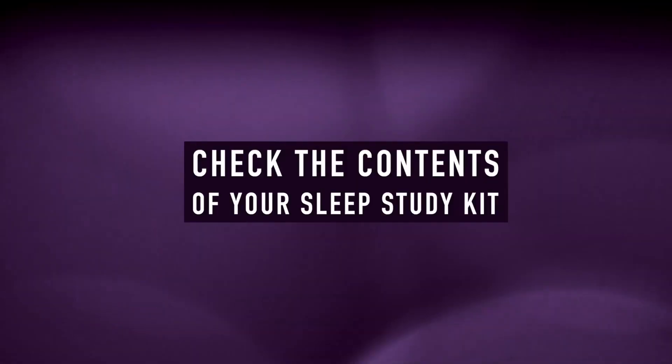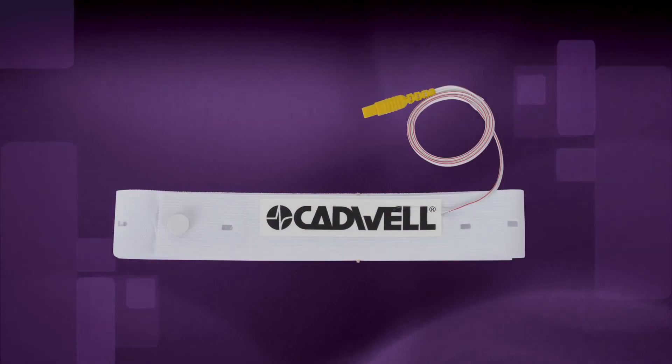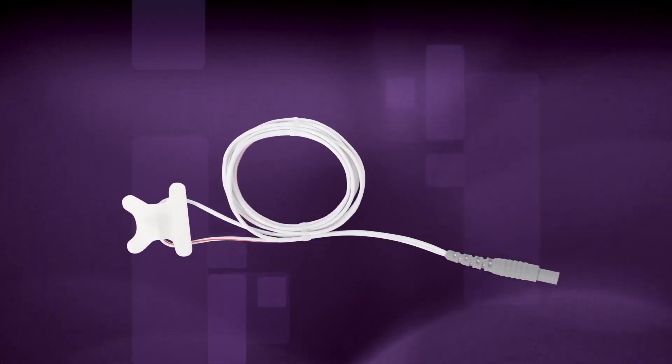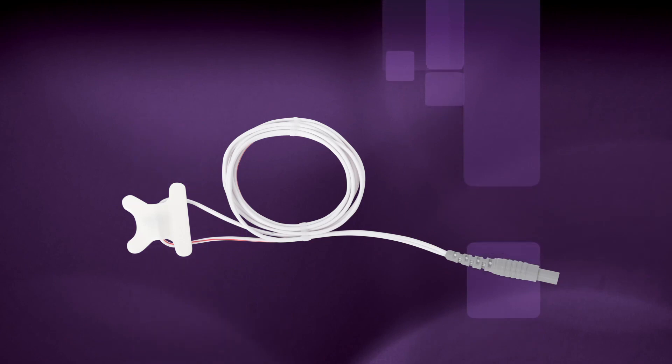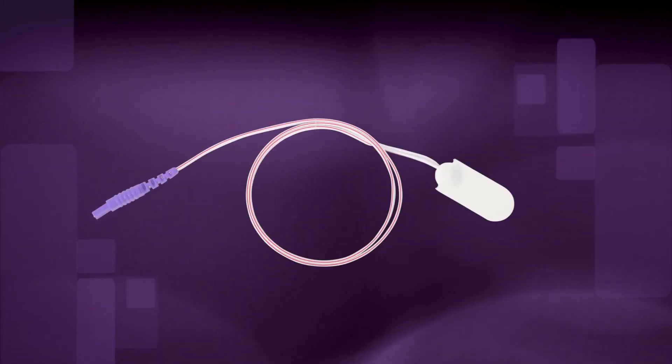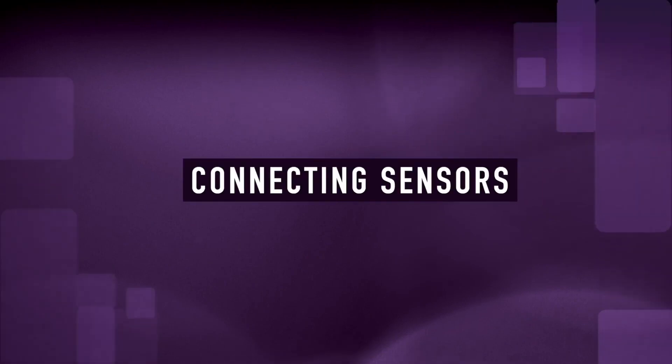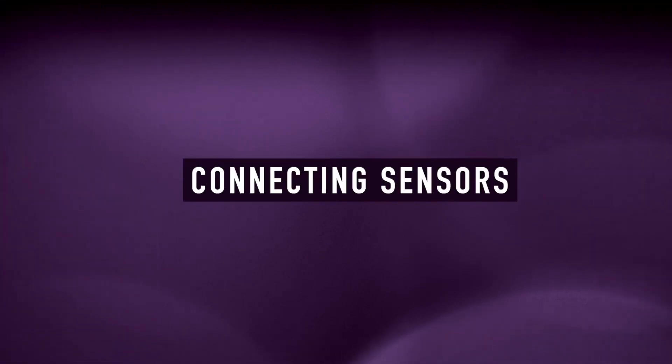As you prepare for your home sleep test, please check the contents of your kit. Verify you have the apnea track, a chest effort belt with a blue connector, the abdomen belt with a yellow connector, an airflow cannula with clear tubing, an adhesive airflow sensor with a gray connector, an adhesive snore sensor with a purple connector, an oximeter finger sensor, adhesive tape, and the patient instruction manual.